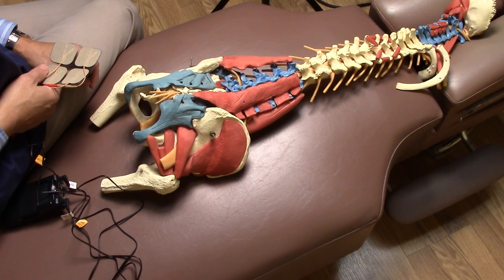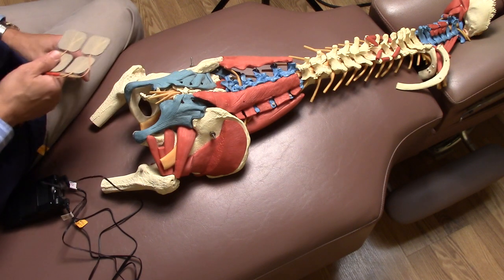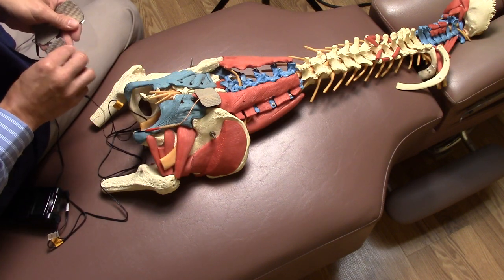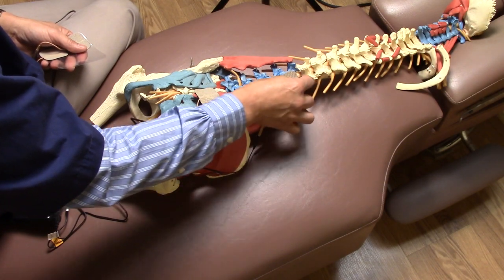If you have lower back pain and it feels like a muscle is spasming — let's say on the right side — you can try this particular approach: put one electrode on one end of the muscle and the other one on the top of the muscle.